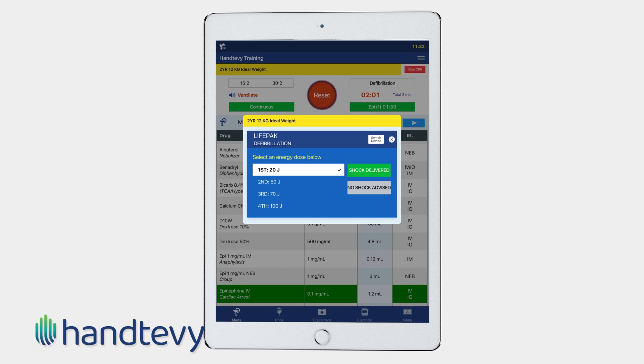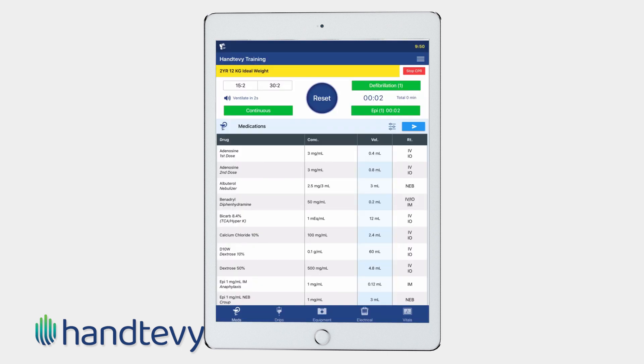Depending on the rhythm, you will select shock delivered or no shock advised. Once you do this, the window will close and the two-minute timer automatically resets.